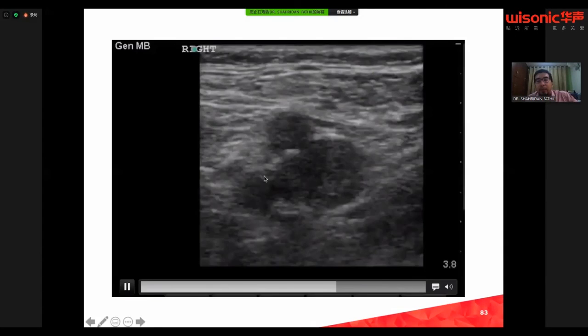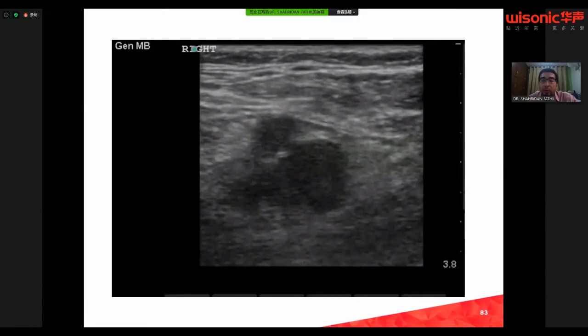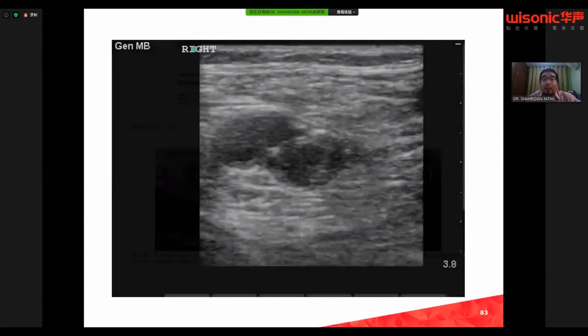You apply enough pressure, and of course, the vein where the thrombosis sits is not occludable. So it's important not to do it too much, because you might dislodge the thrombosis and cause pulmonary embolism itself. There have been other findings as well.